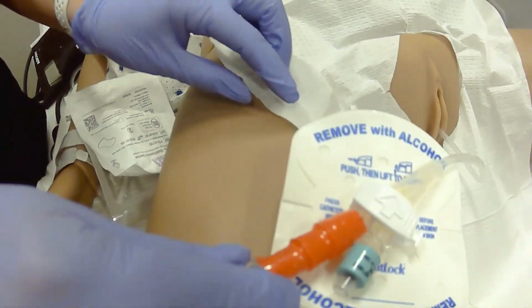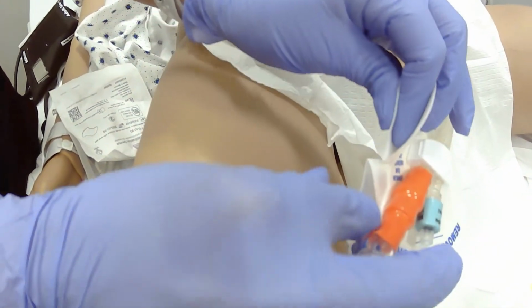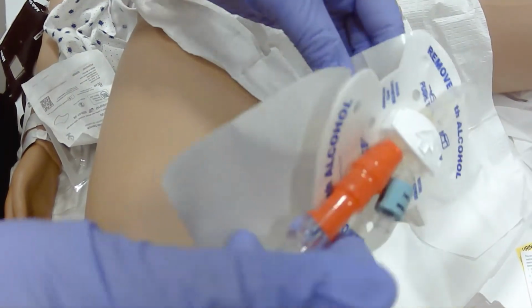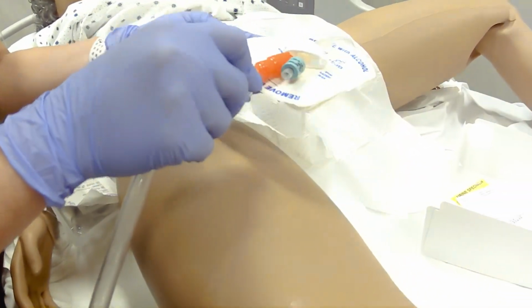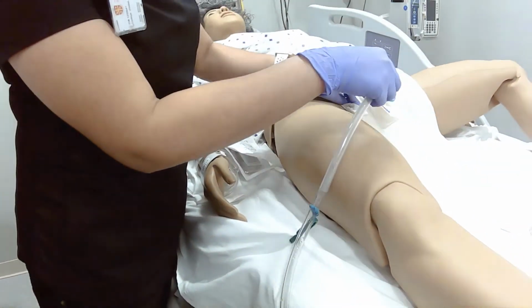There we go. For these purposes, we'll remove this piece and that piece, and it will stick onto the patient's leg. But I'm not going to do that for real, so that we can demonstrate the removal.